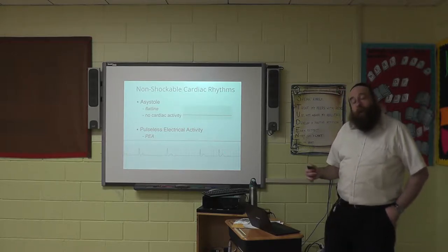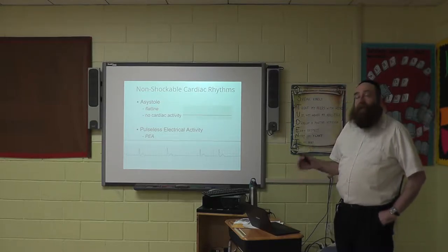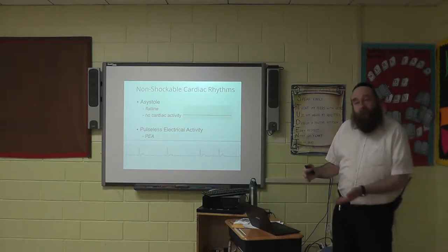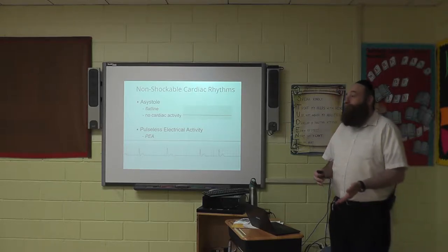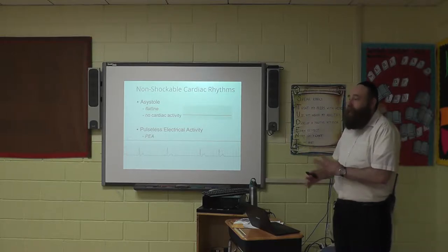Okay, so if you're working up a cardiac arrest with a medic, and a medic says, oh, I've got a rhythm, somebody has to check for a pulse. Because if there's a pulse, you may have a blood pressure and the patient may be back. You have to check for a pulse after you stop CPR, because the pulse could be caused by the compressions. We're talking about during a pause.